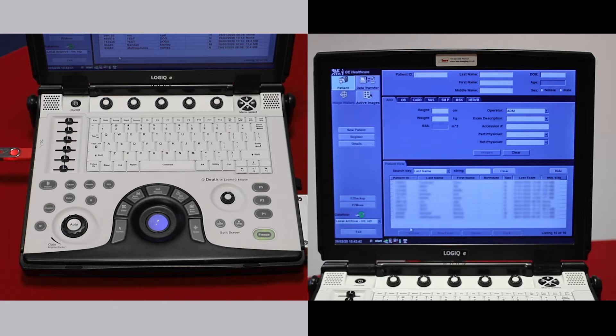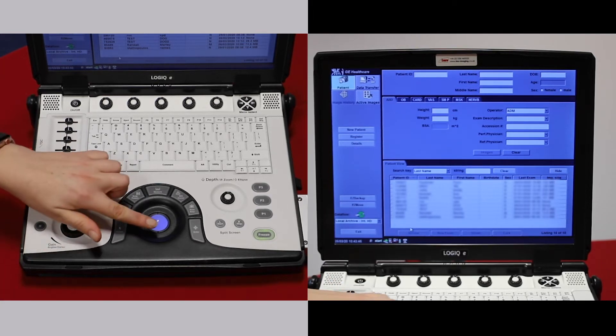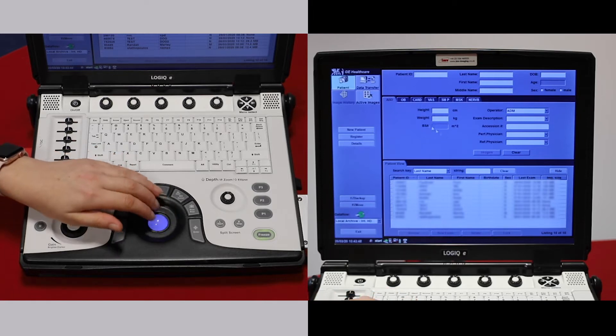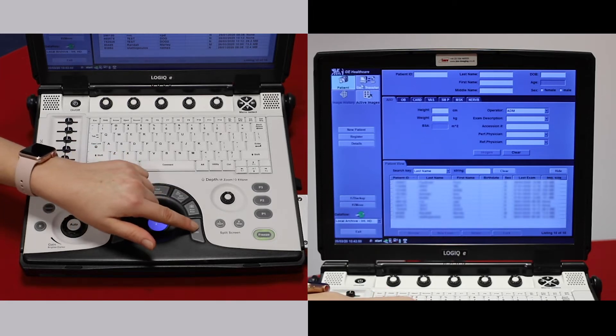To export images as DICOMs for referral, go to data transfer in your patient screen.